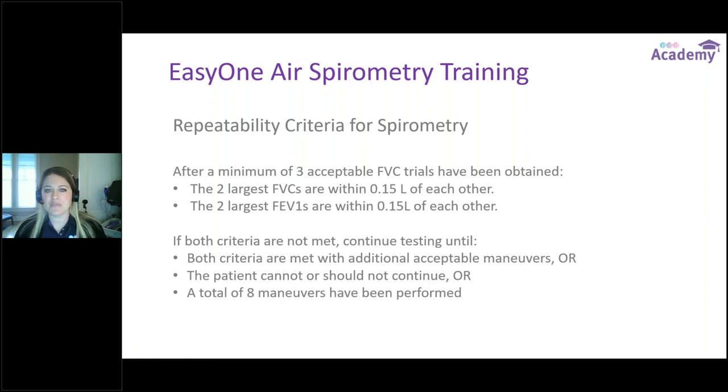Repeatability criteria for spirometry: we always want a minimum of three good, acceptable, reproducible tests. After a minimum of three acceptable FVC trials, we want the two largest FVCs and the two largest FEV1s to be within 0.15 liters of one another. If those criteria have not been met, we keep testing until we either meet criteria with more trials, the patient cannot or should not continue, or we've reached a maximum of eight trials.